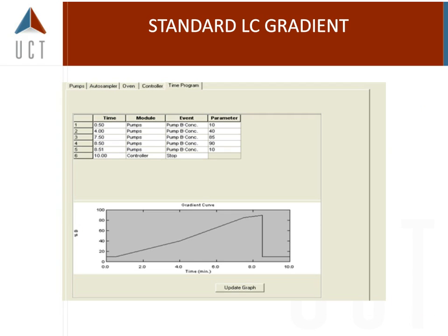7-aminoclonazepam was a troublesome compound, and I'll show you a slide earlier how UCT, after they realized this, made suggestions into changing some of the wash solvents, and then all of a sudden what was being washed off a column because the phase was too strong was actually washing some of the 7-aminoclonazepam and other polar compounds off. So by using that reverse phase biphenyl LC column, we realized that a polar compound like 7-aminoclonazepam doesn't stick.